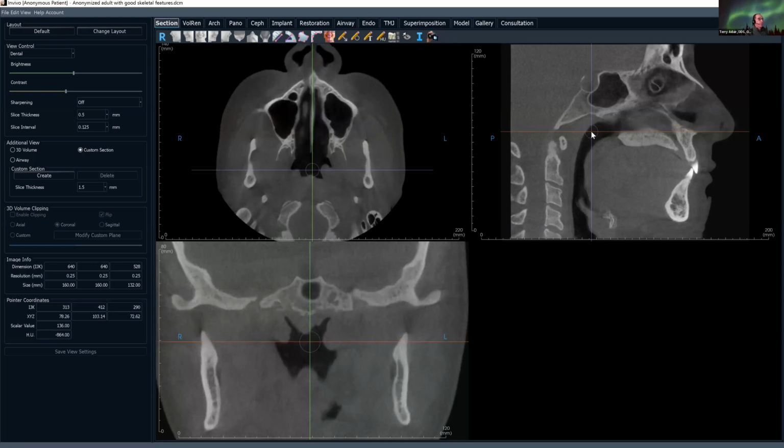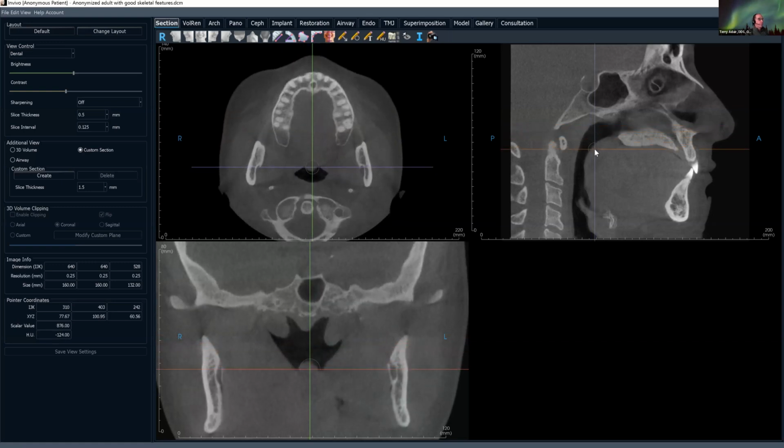But I am focused just on the airway at this point. And the reason I want to just focus on the airway is several structures appear as you scroll from the superior down to the inferior, down to the epiglottis. And there's 5 structures that appear there. I hope I can remember them all. Probably the first one you're going to come across is tonsils. They are on the lateral border of the airway.